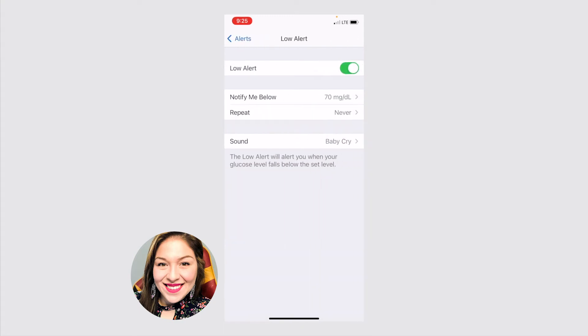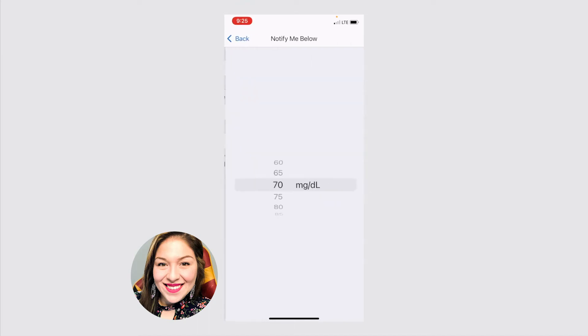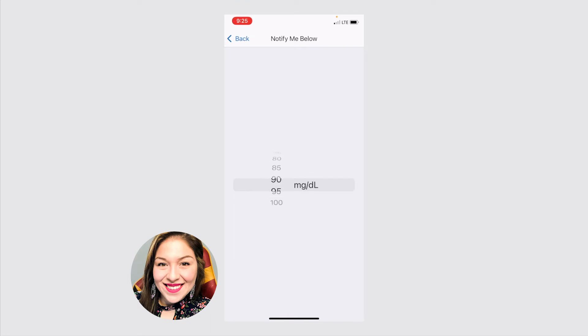We'll click on low here. You always want to have your low alert on just for your safety and for in case of emergencies. And here's where you can set it to notify you at what level you want to set for low. So the lowest you can go is 60. Again, for your safety, but you can adjust it for as high as 100. This is something that you'll want to discuss with your healthcare provider to see what you want your low and your high thresholds to be.